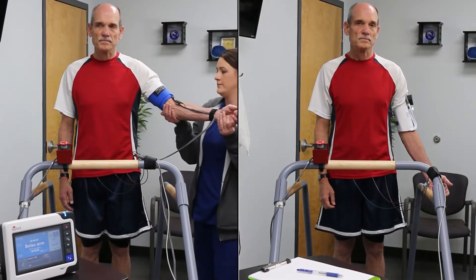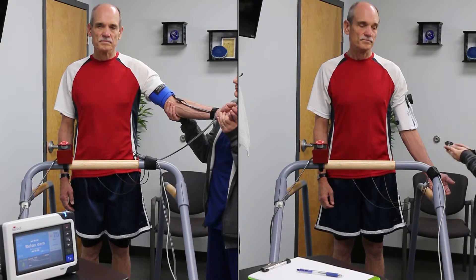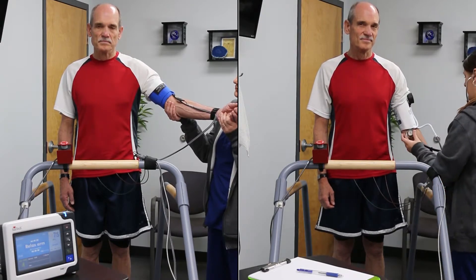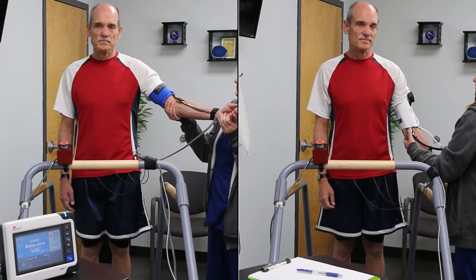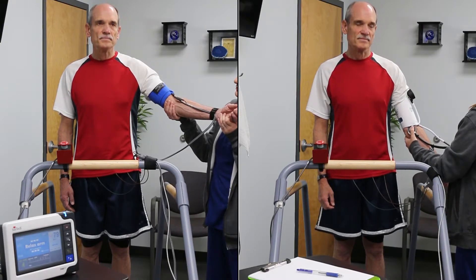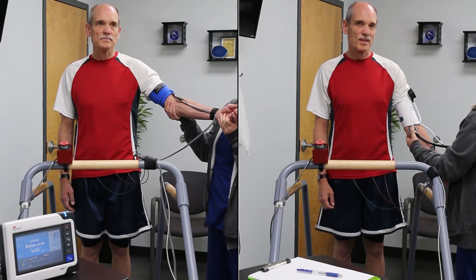The Suntec Tango M2 is an automated blood pressure monitor designed to get quick and accurate BP measurements during an exercise stress test. An exercise stress test is used to gauge how well the heart works when it has to pump harder and use more oxygen. This video compares the ease of BP measurement using the Tango M2 to the traditional method of manual BP.